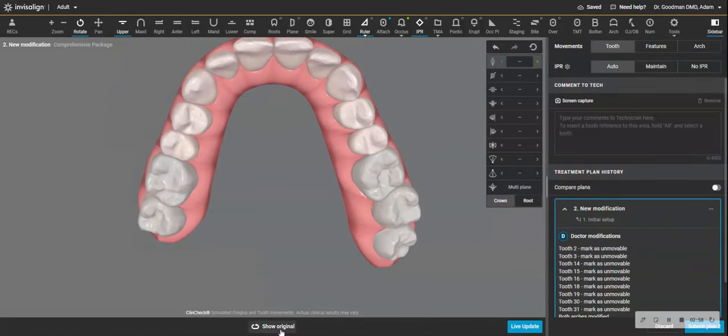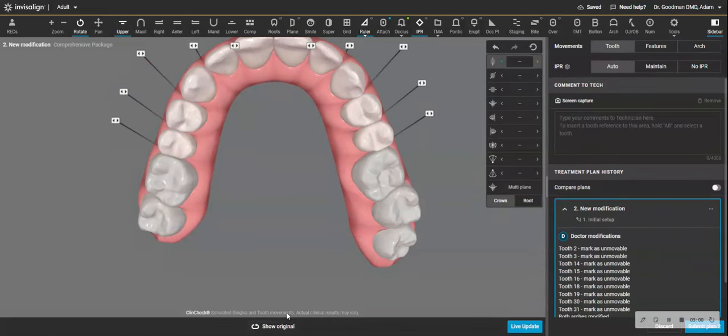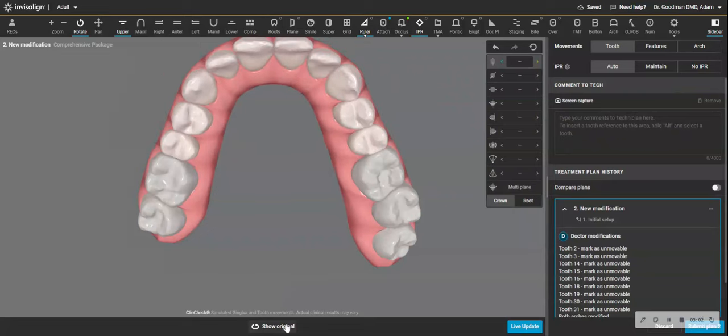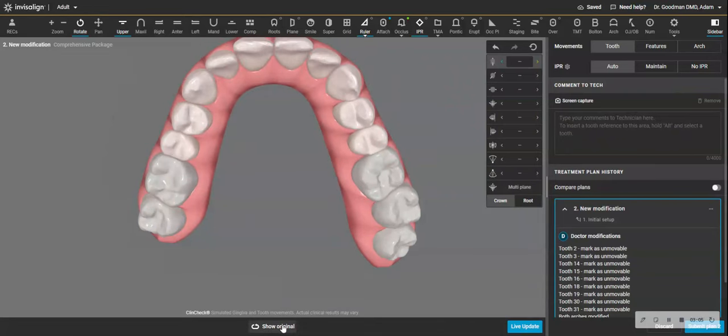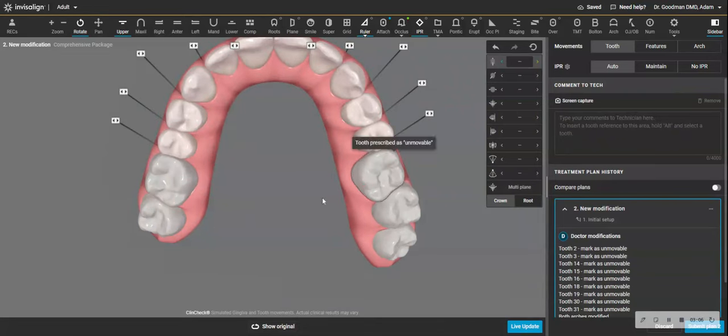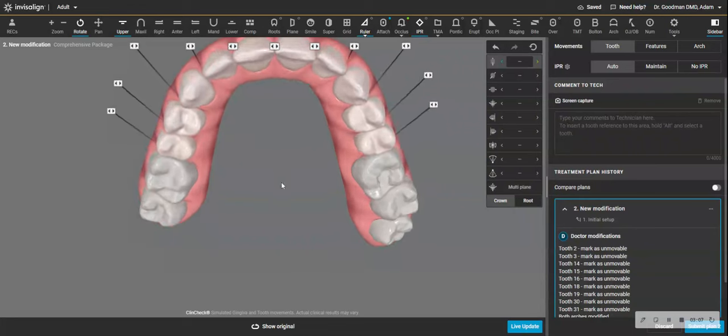I've expanded in the premolar region, which is where I need the expansion. And now I have an even stronger anchor using these static back teeth.